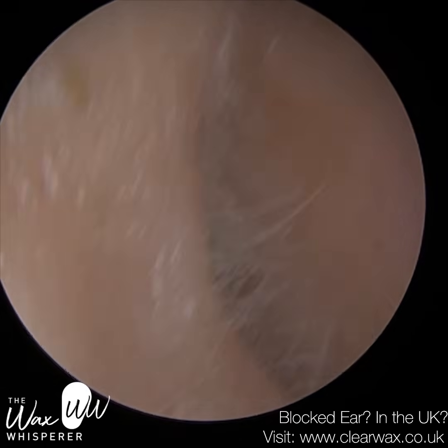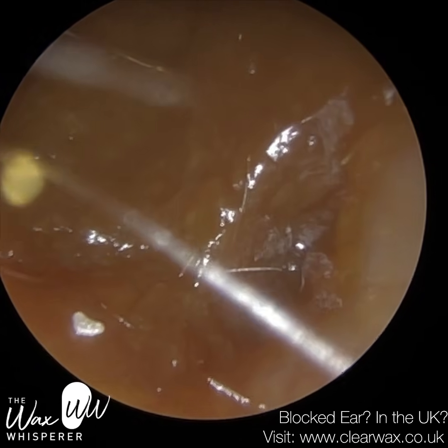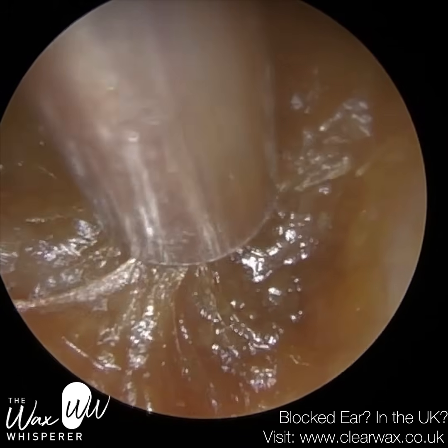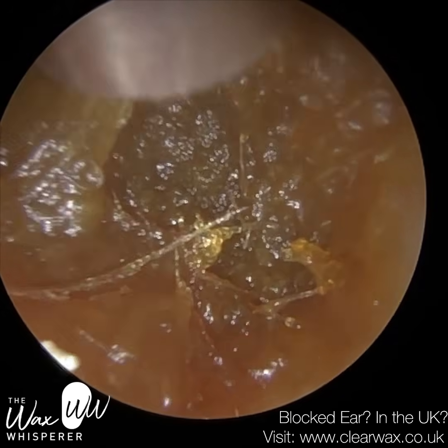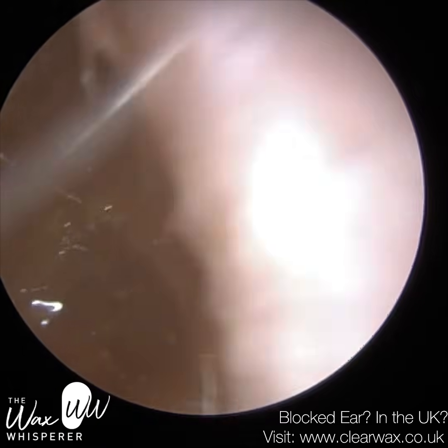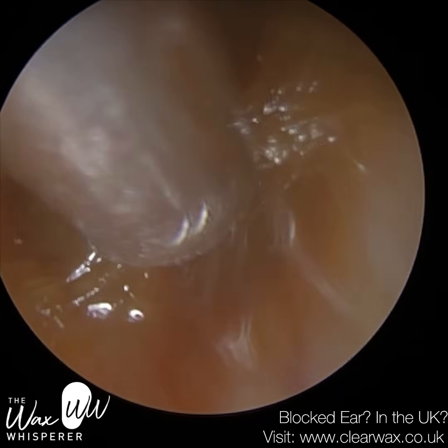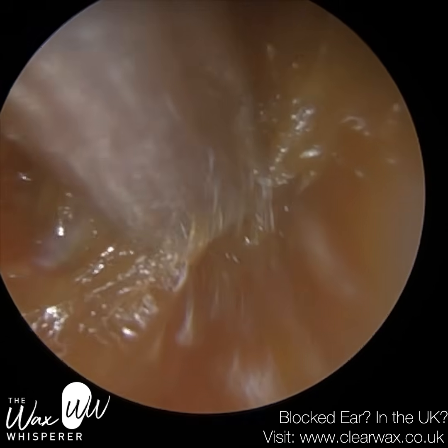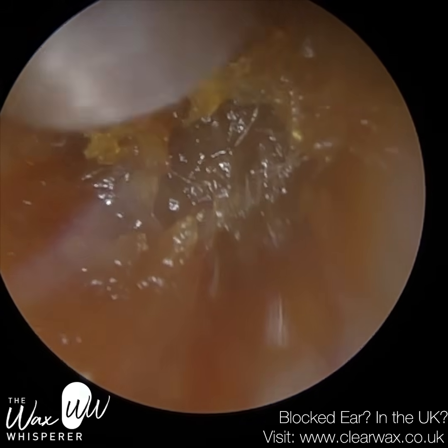So I've just cleared up the residual wax and skin on there, and that ear looks healthy enough. Now in this ear, the patient had been using drops to soften the wax, and they informed me that after putting the drops in the ear, what they did, and the instructions are not very clear on these drops when you read the instructions for use, they just tilted their head across, so the ear that they put the drops in was facing towards the ceiling to allow the drops to penetrate deep in the ear, and they left it there all night.